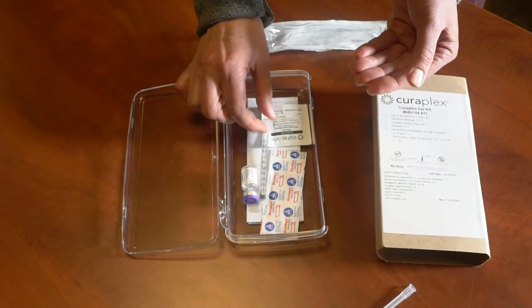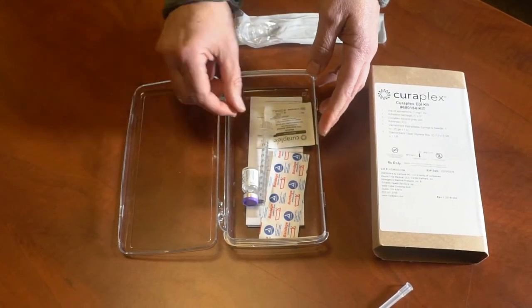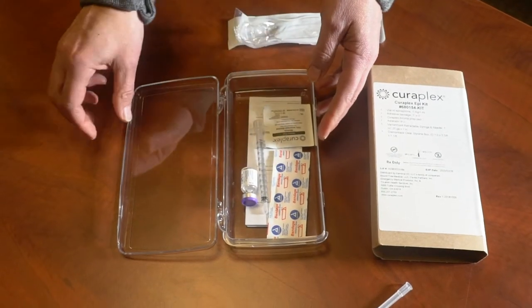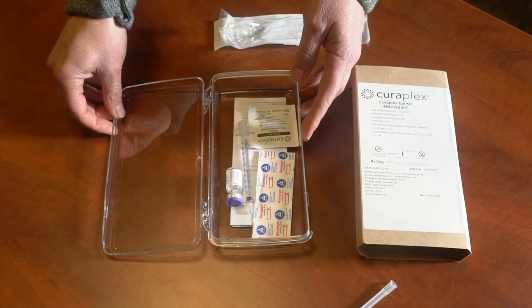I want to make sure all of you get your hands on this in your classes so you understand how the new syringe works and how the new numbering is. Good luck out there and stay safe. Bye.